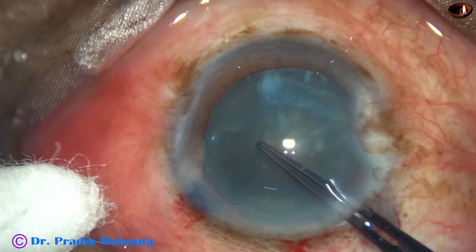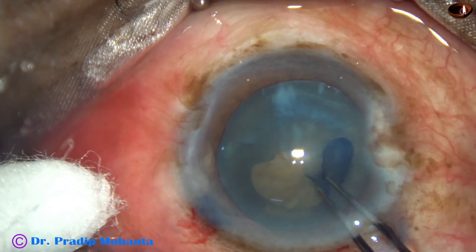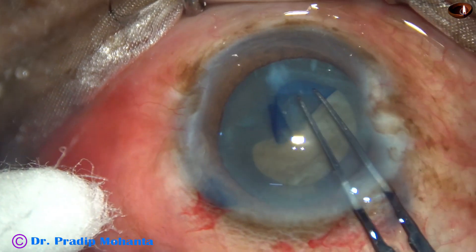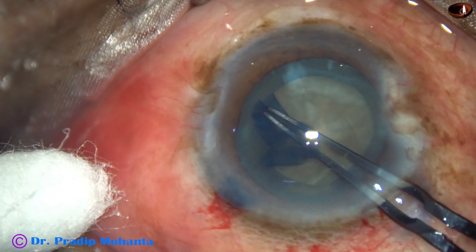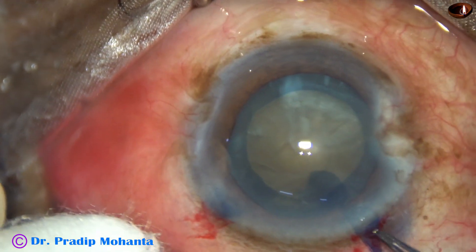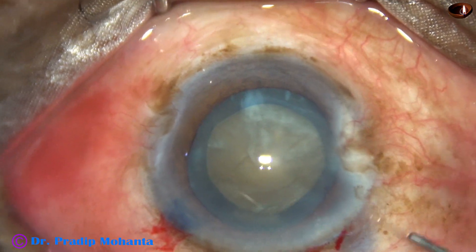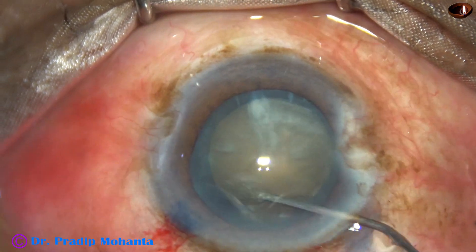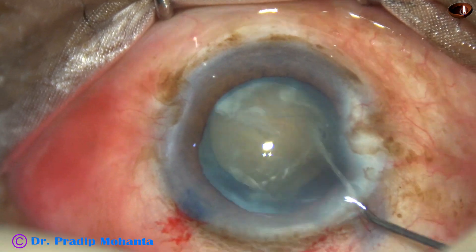And now capsulorhexis. The anterior capsule is torn. A capsular tag is raised. This capsular tag is guided all around to get an adequate sized rhexis of about 5 mm. Now hydro-dissection is done. This is a 27-gauge cannula, and BSS is used in a 2cc syringe for hydro-dissection.